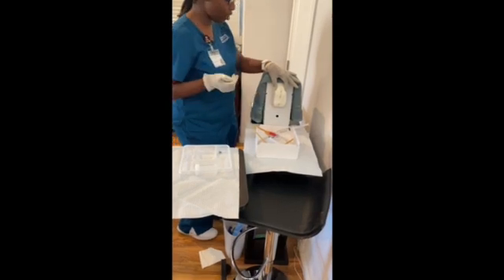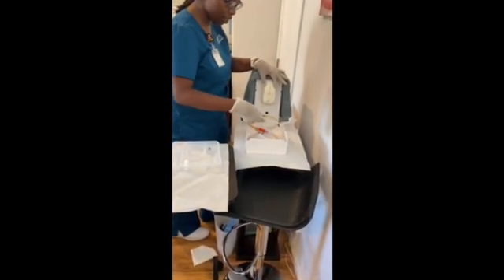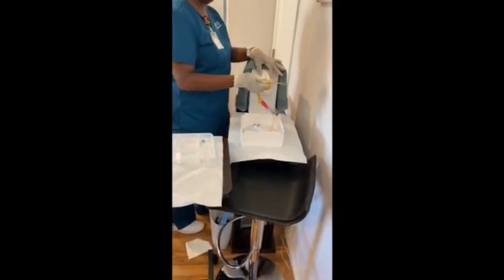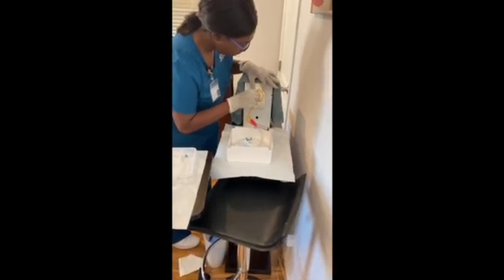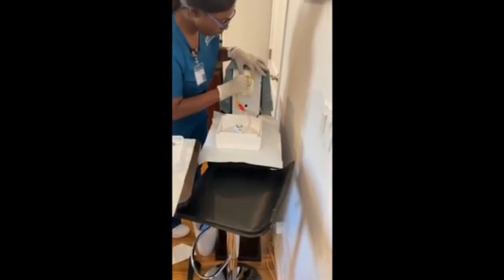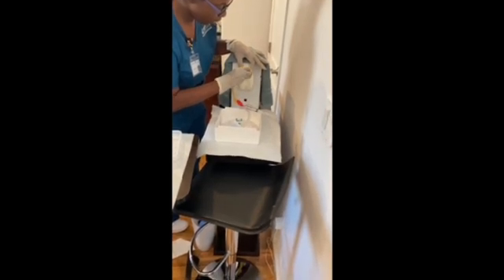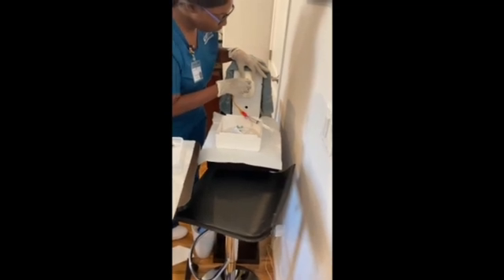Okay, Mrs. Taylor, you might feel some pressure. Go ahead and take a deep breath while we start inserting this. Okay. So we're about 2 to 3 inches in and I see a flash of urine. So we're just gonna keep going about 1 to 2 more inches.